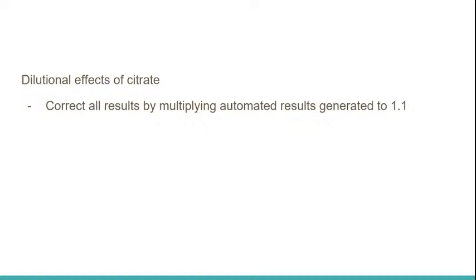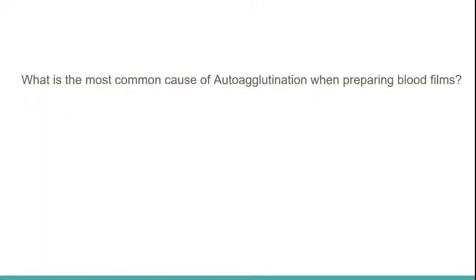And of course, one of those things that we need to take note of is the dilutional effect of citrate, because they are liquid. Mixing liquids together causes dilution. One is the solvent, one is the solute, and in this case, the solute is the sample itself, right? That's why we need to factor in that particular part of the sample.